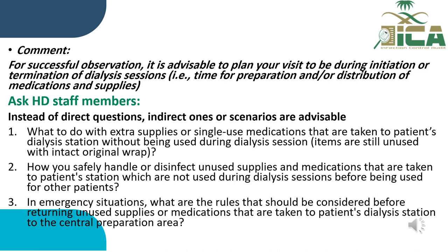Or ask, in emergency situations, what are the rules that should be considered before returning unused supplies or medications that were taken to patients' dialysis stations to the central preparation area?